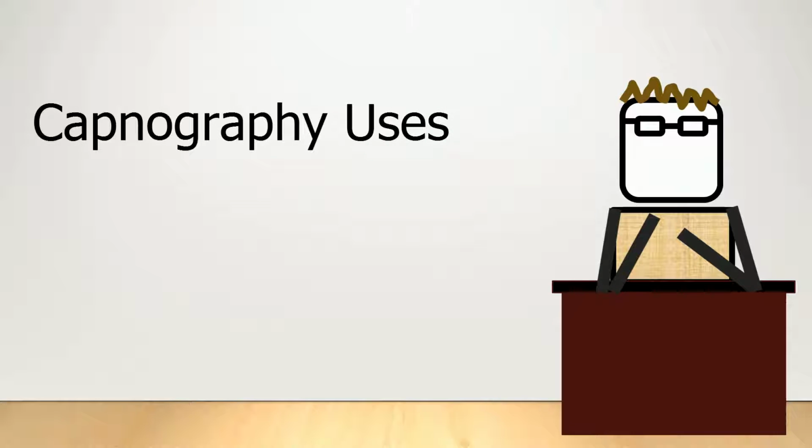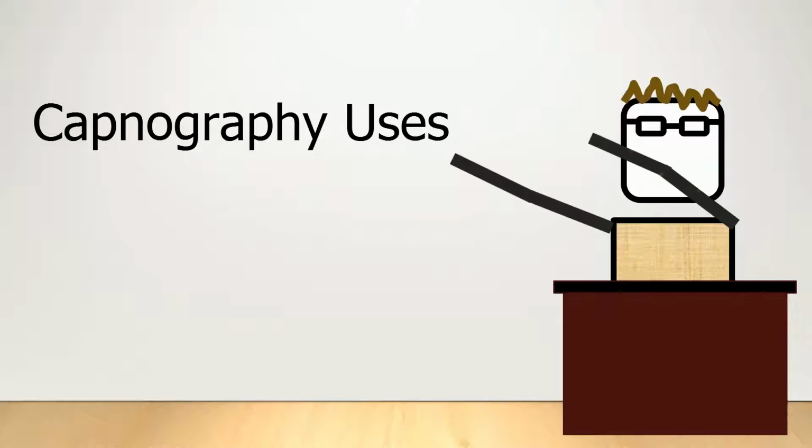Welcome to a basic introduction to mechanical ventilation. This is chapter 3.4, Capnography Uses.